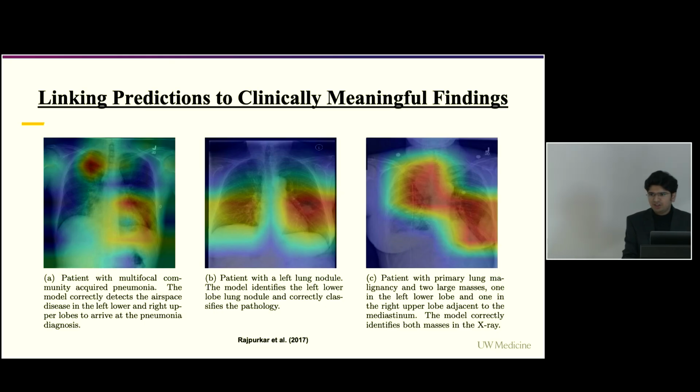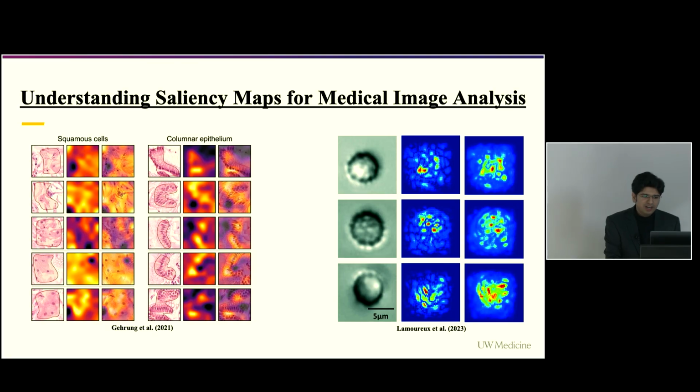And this is not just for, as I said, grayscale images like mammograms or chest X-rays, but you can do it more for multi-scale images, like microscope images and whole slide images, wherein you can see whether it is looking at the cell type correctly, whether it is picking up on the right set of morphological features or not, and go ahead and make more hypotheses about its inference mechanism, validate, and understand its decision-making process. So is this it?